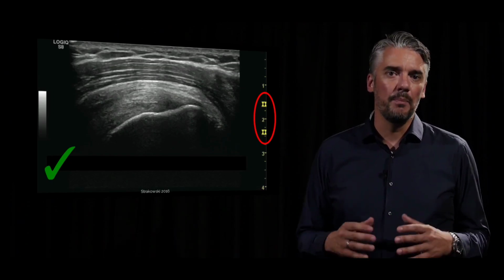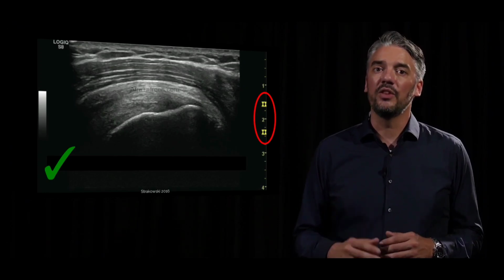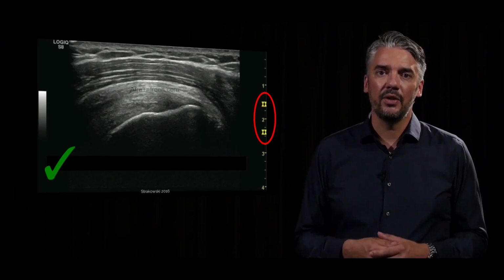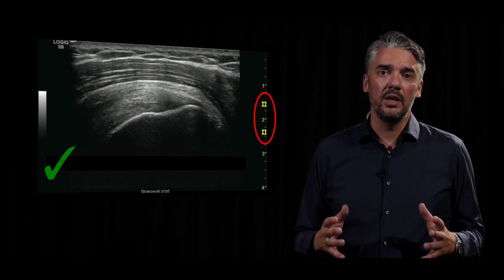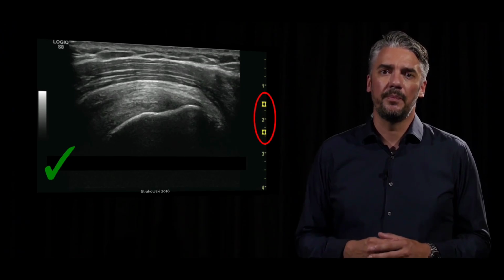However, where most people get unstuck is the positioning of the focal point when scanning a structure that is much wider in the plane parallel to the ultrasound beam, for example, if it has a significant depth on screen. Intuitively, most people will position the focal point at the midpoint of such a structure.